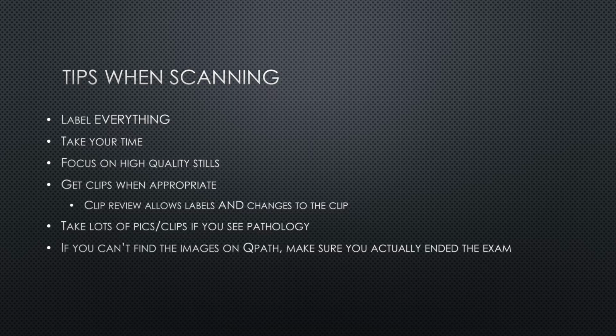You would not believe how often this comes up. If you don't actually end the exam, the images aren't going to show up on QPath. So please make sure if you can't find the images that you actually ended the exam.